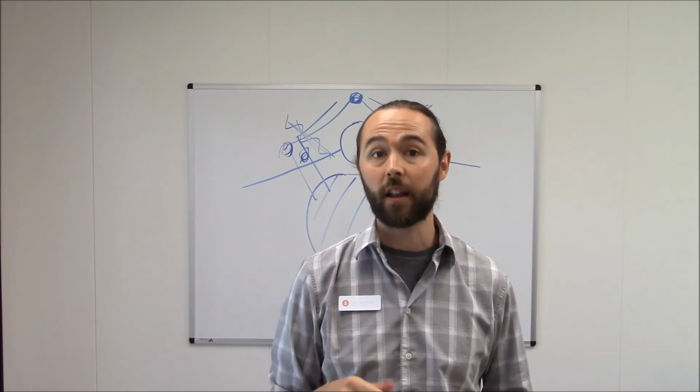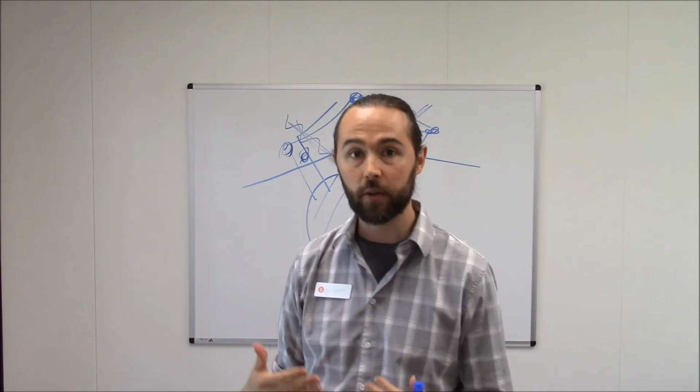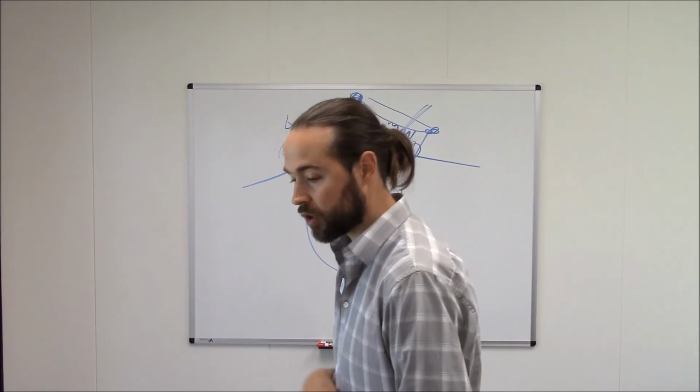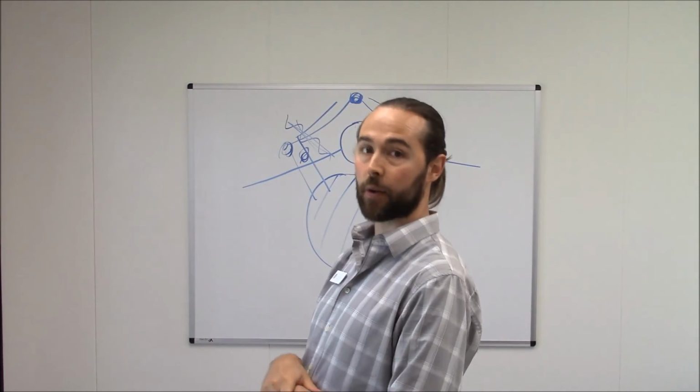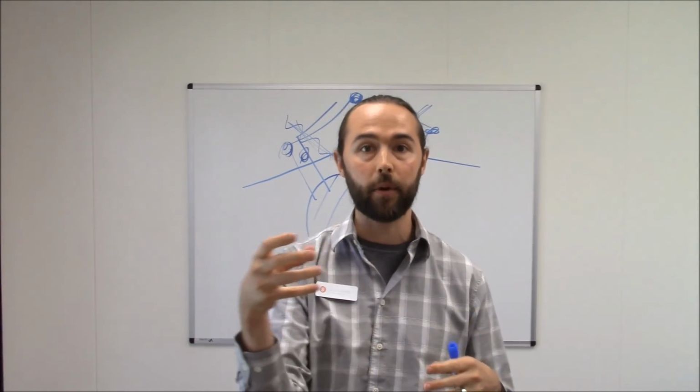Those folks usually, it doesn't go undiagnosed very often, but it can be an issue. The way they often diagnose that is, instead of just a static upright x-ray, you'll do what's called a flexion extension x-ray. You'll bend forward and then bend backwards, and they'll take 2 different pictures and see, did that vertebra move? Did the backbone move forward and back?